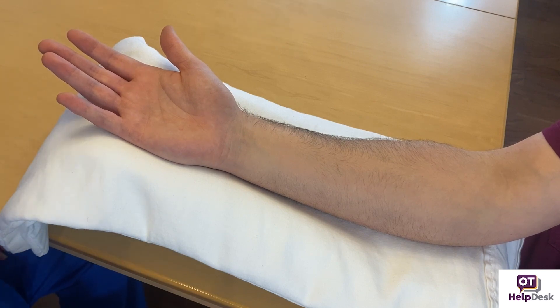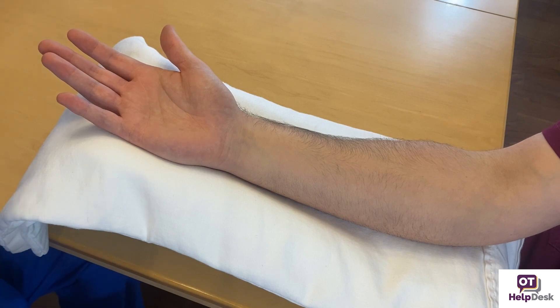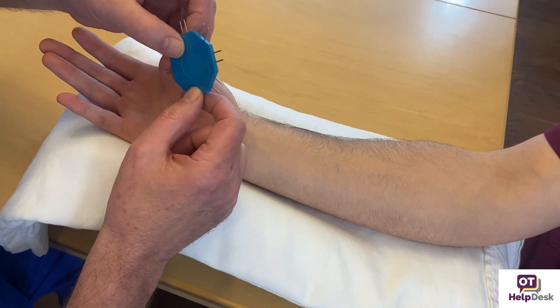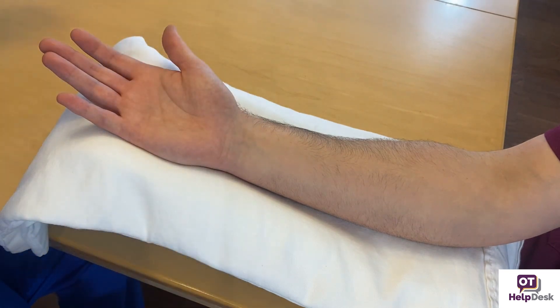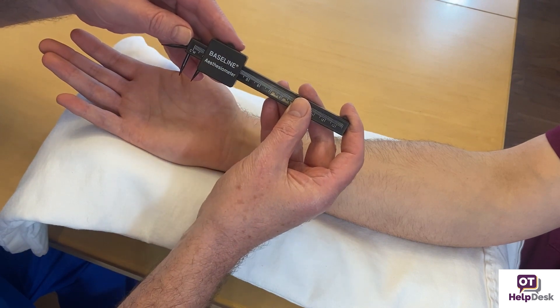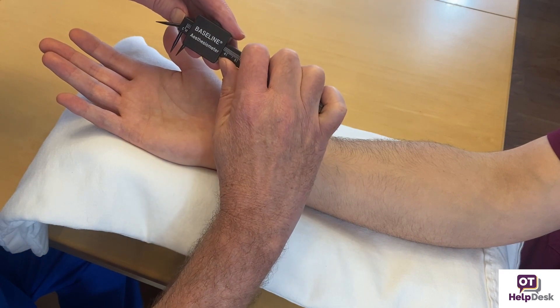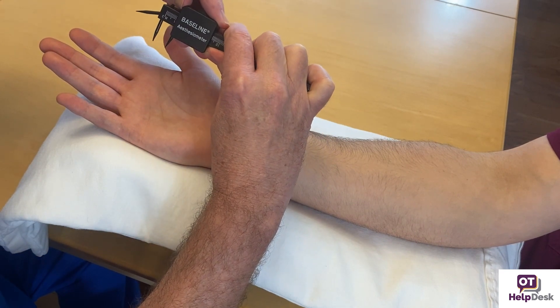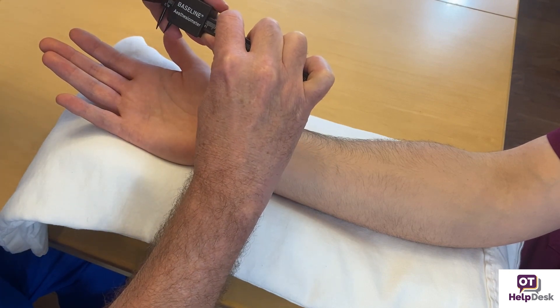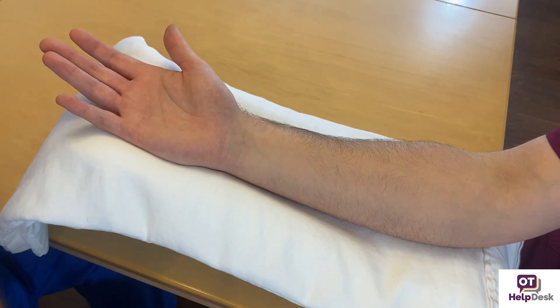In this case we are going to use one of two tools. The first one is the discriminator, which has two points. The second one could be the esthesiometer, also known as the Boley gauge — B-O-L-E-Y — and you can see that gauge can move by millimeters. I'm going to set this at six or seven millimeters for the first one we're going to do.